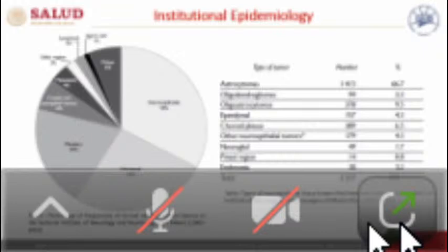The localization of the eloquent areas in pathologies that deform the anatomy is sometimes unknown, because in other conditions it is known in a normal situation. And the other challenge is that postoperative neurological deficits range from 4 to 16, 17, sorry, for perirolandic glioma. So this is a critical area.